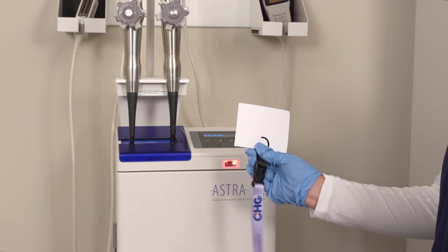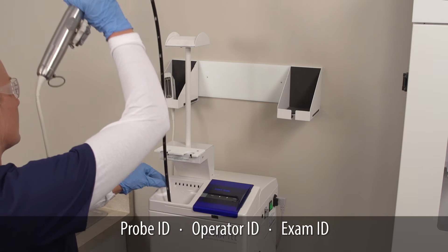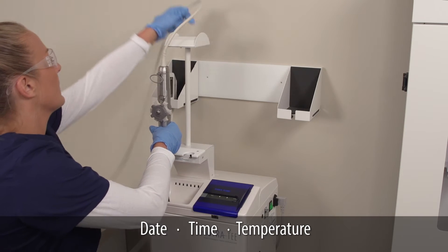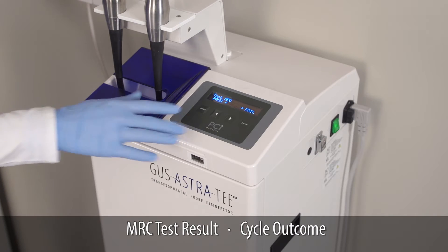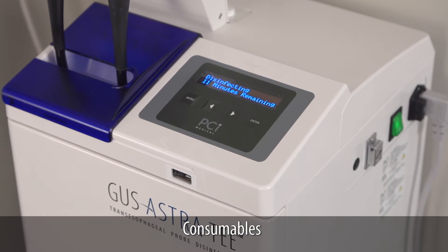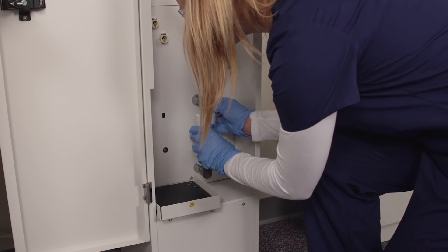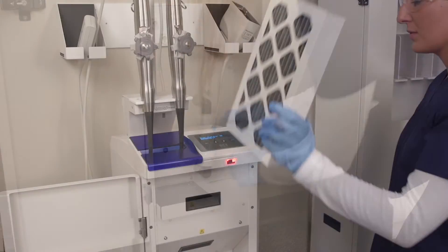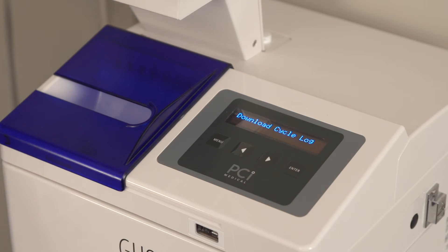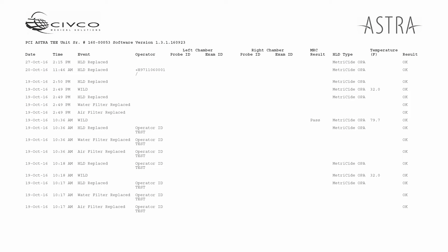The Astra barcode reader automatically captures key data such as probe ID and operator ID. Date, temperature, and more are also automatically captured by Astra. Easy-to-read, step-by-step prompts walk you through the disinfection process. Astra automatically tracks consumables such as filters and disinfectant solution, making it a fully automated system. Data from the last 2,000 cycles are stored on Astra, resulting in an accurate disinfection log that saves you time.